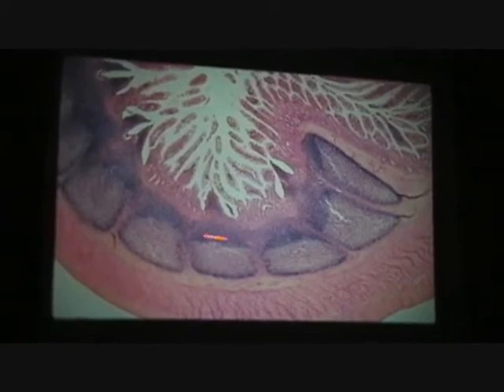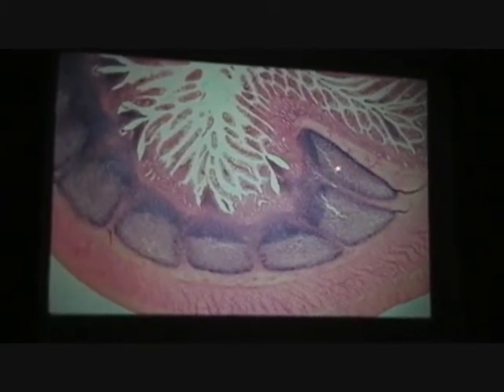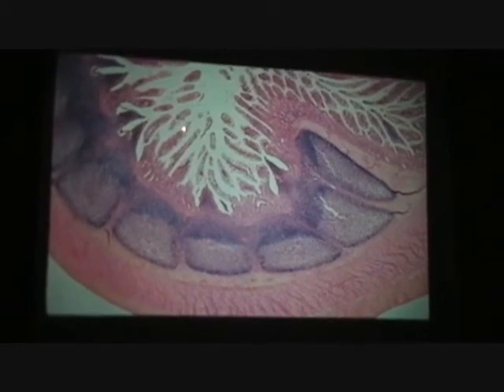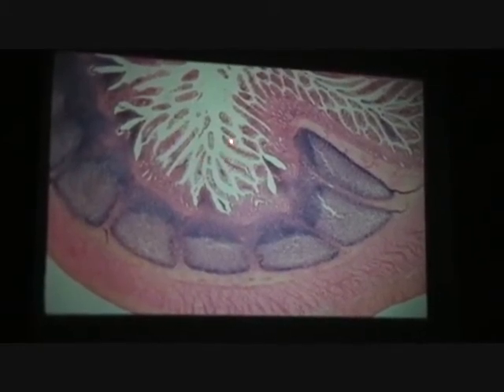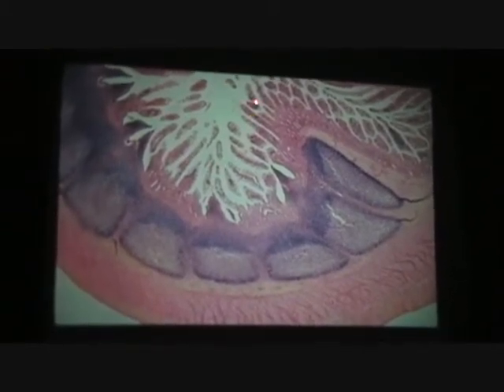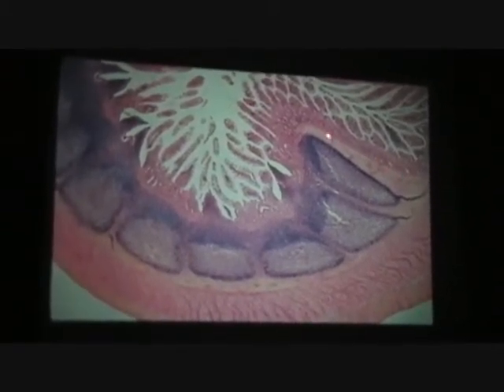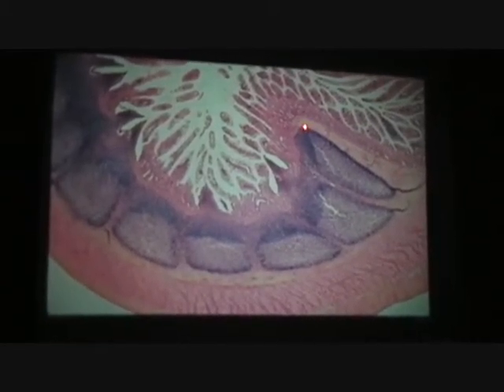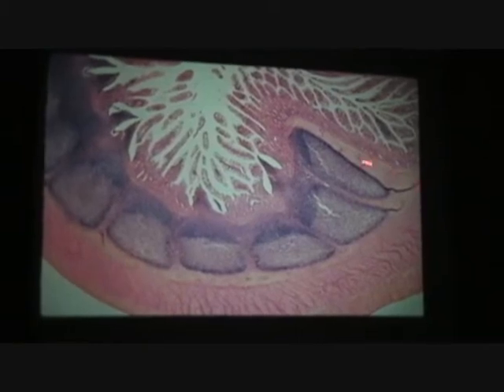These lymph nodes. So that's good. You say, yep, that's the tip off. What are these? Villi, a little bit fragmented, still villi. What's this? Little hill, gotta be a plica, yeah, little pleat.